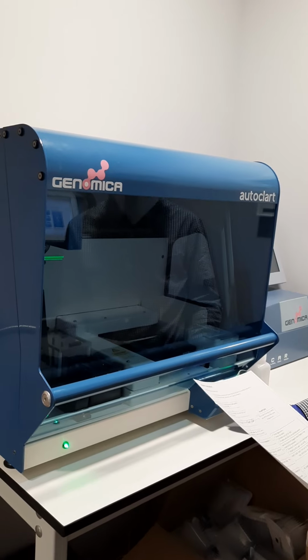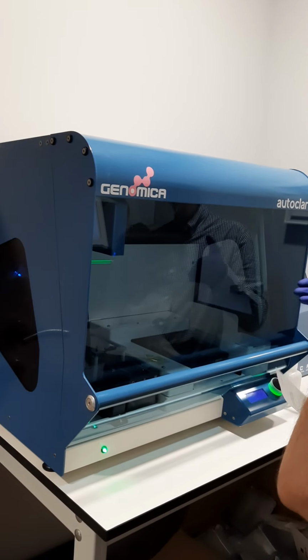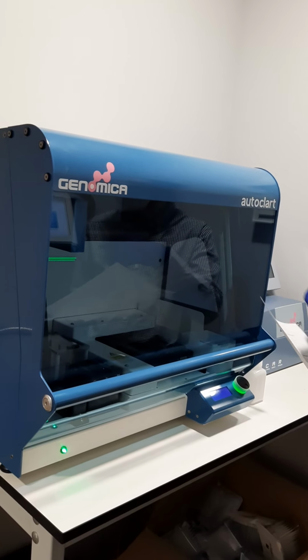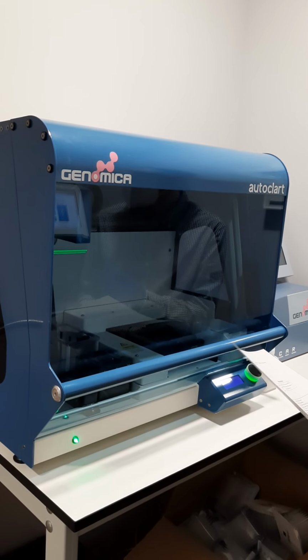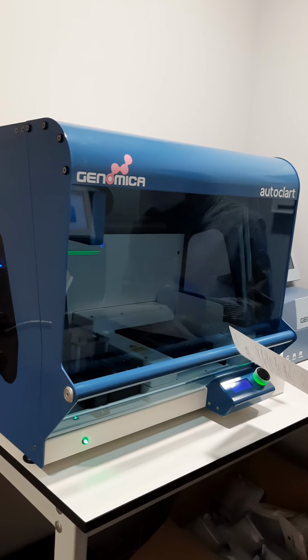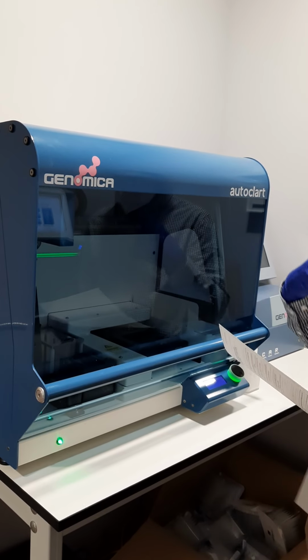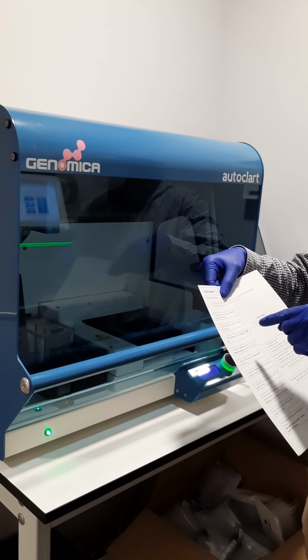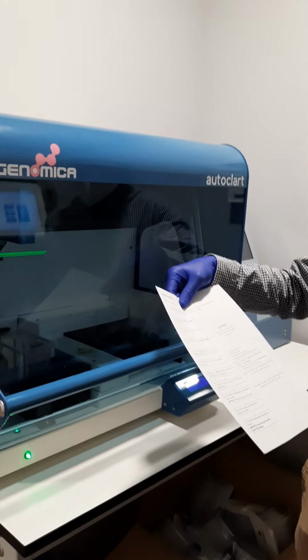And okay, it's going to ask where to start. It can start with the CS. I don't know if you have seen the wells that we have. In the visualization part, the genotyping kit, we do the detection of the amplified product in arrays. When we are going to do it, you will see that our arrays are strips with 8 wells, and in the bottom is printed the DNA.